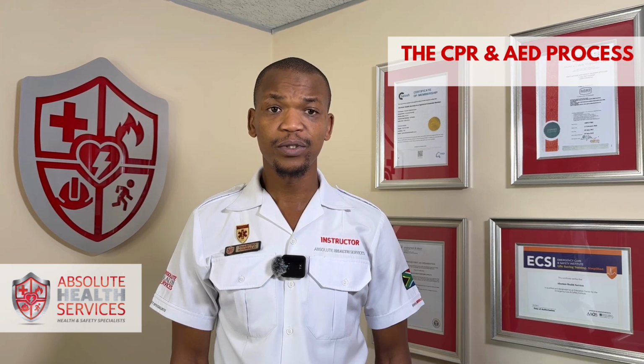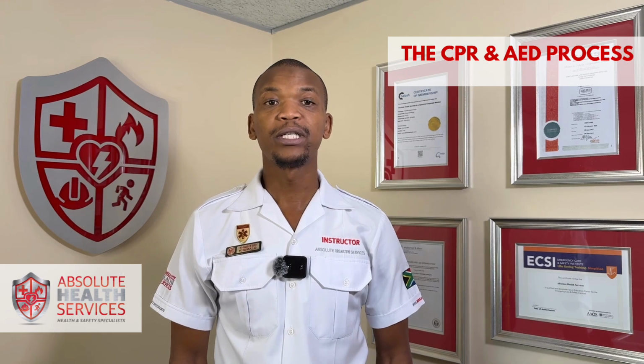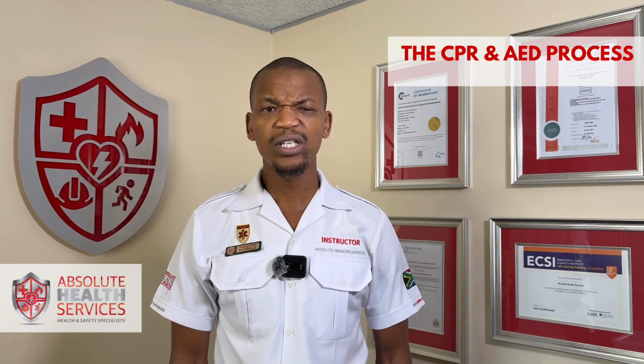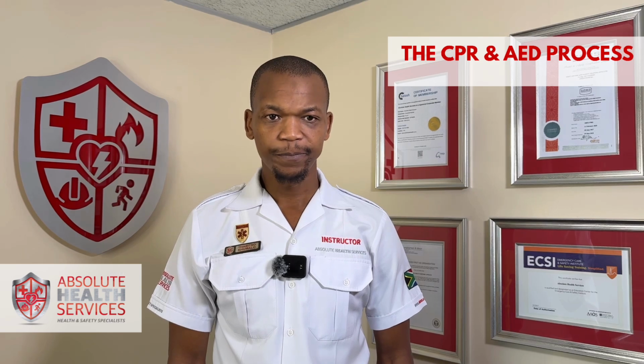When you compress on the chest, ensure that you compress deep enough, at a compression depth of about 5 centimeters, which is about 2 inches, for adults and children. This will be slightly different in the case of an infant, where you will compress to a depth of 4 centimeters. It is very important that we try to achieve a high CCF, which is chest compression fraction, trying to reach 100 to 120 compressions per minute. This increases the chances of survival by at least 10%.